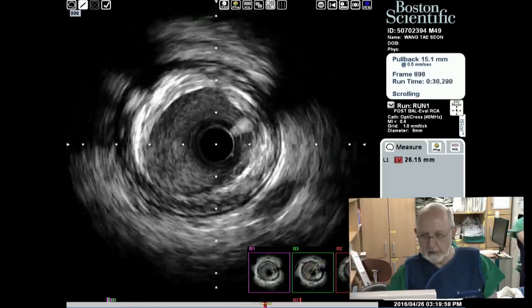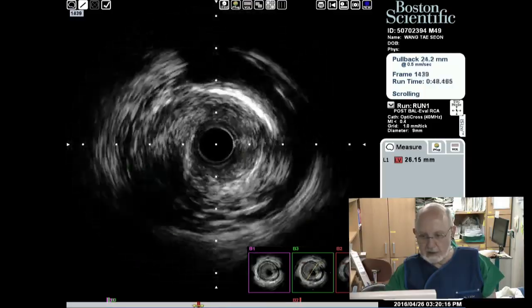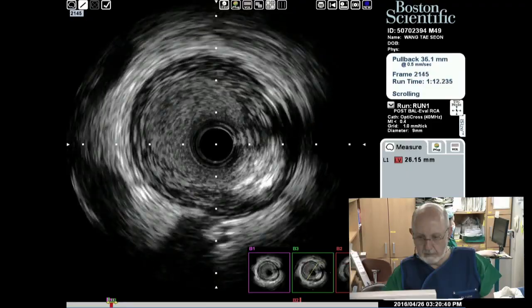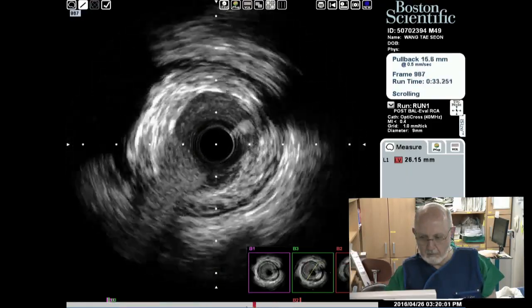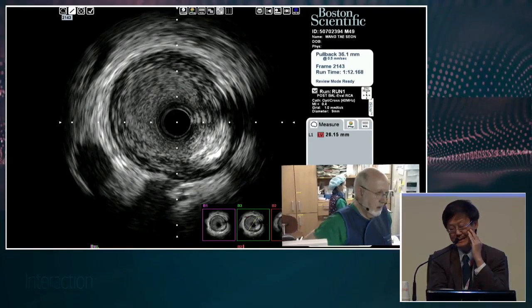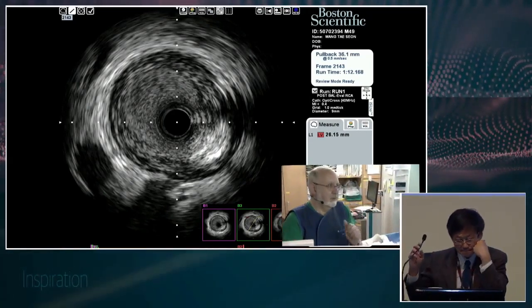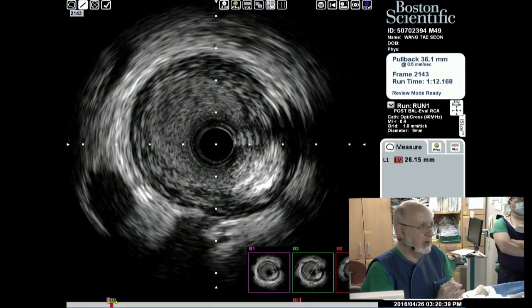For example, here there's no attenuated plaque, even though there's a large plaque burden. You see mostly deep calcification. Following the question of how often you recommend it: attenuating plaque has a higher incidence of maybe 10-15% slow flow, so we may consider distal protection with a filter. There's a practical aspect to being able to protect the distal vessel in the CTO, but most of the time it's really not an issue.